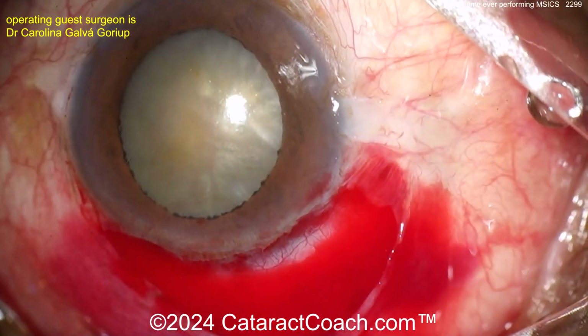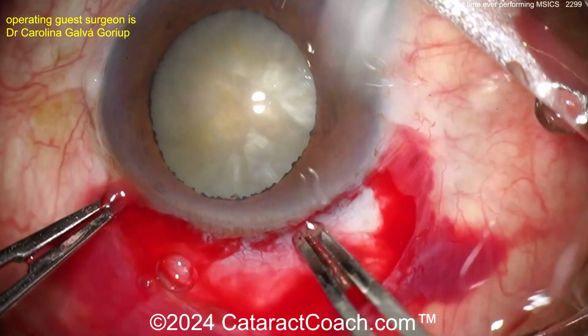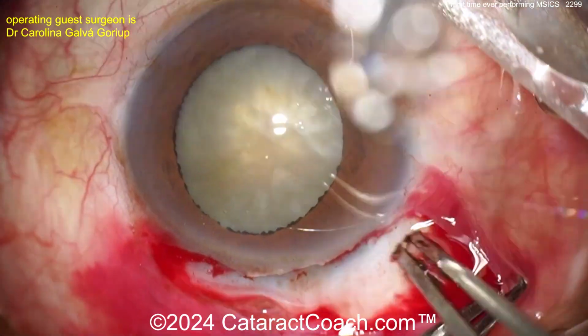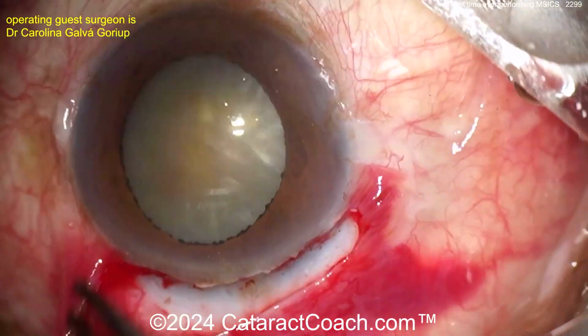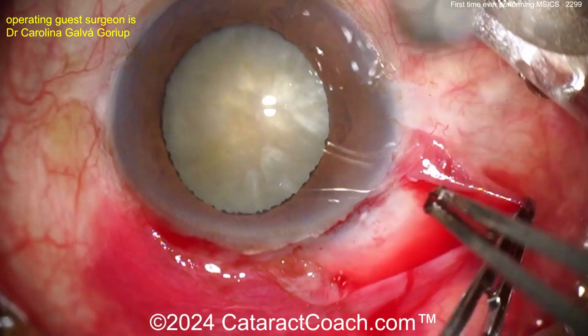If you're an experienced phaco surgeon, you already have the skill sets. This is going to be easier for you than phaco. So again, here's a surgeon sitting superior, doing a peritomy of the conjunctiva, and now getting some cautery done. That's important to do. And the key to this surgery is the incision.